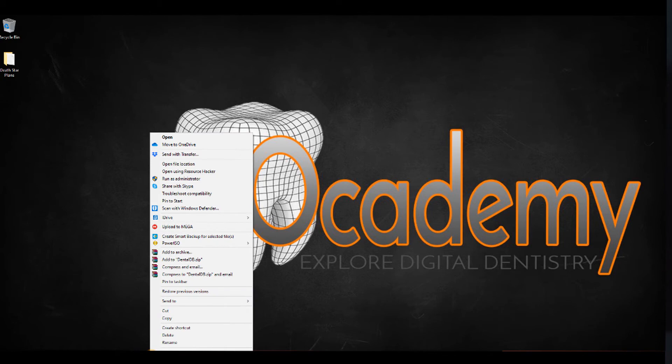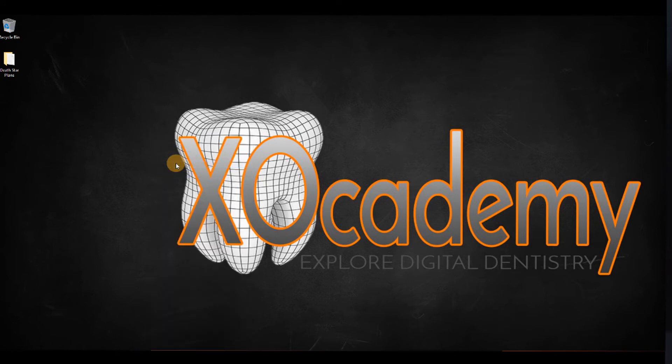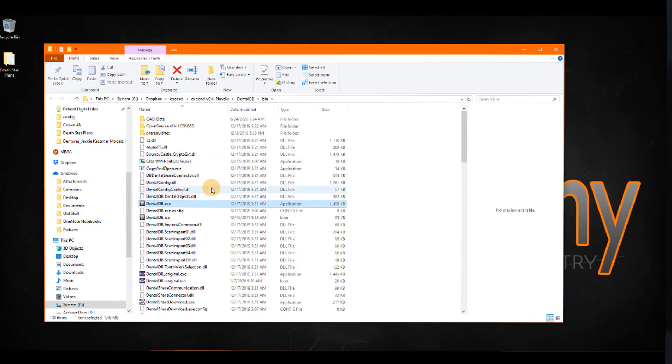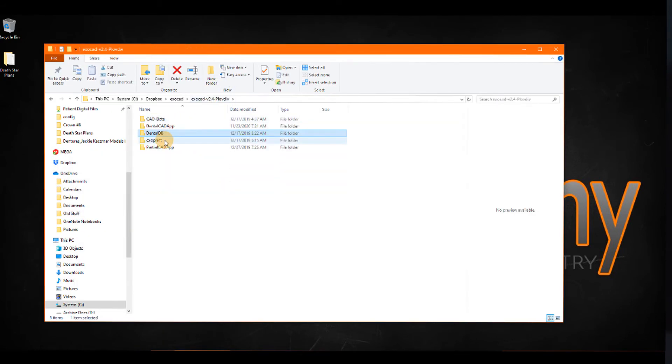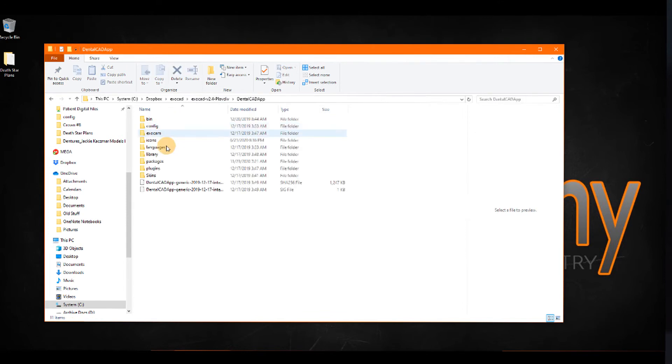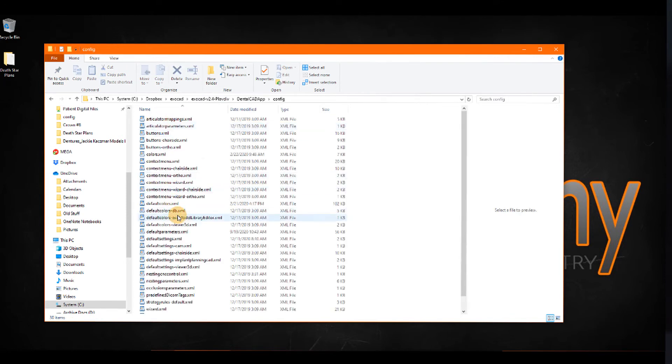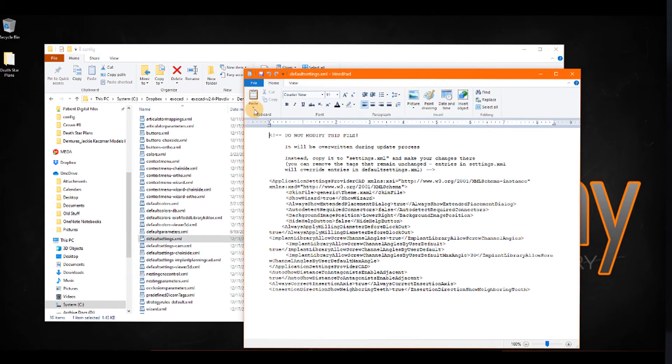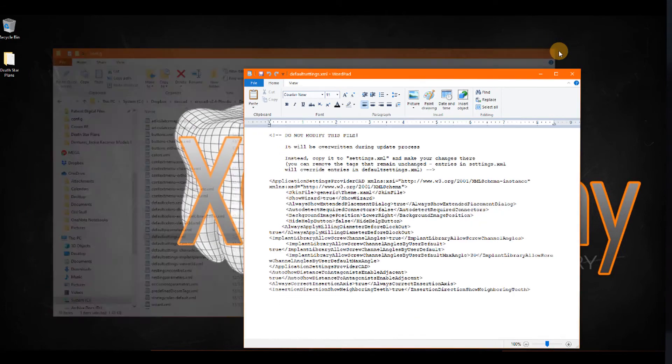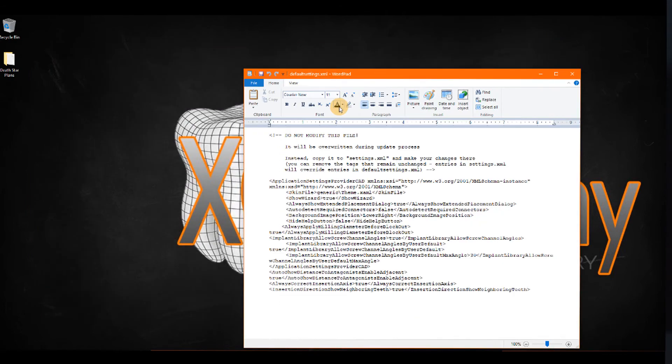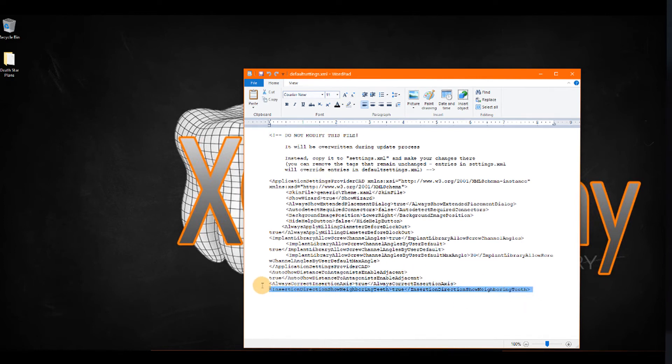I'm going to go back to that file to see what the issue is. So, DentalCAD app, config, and defaultsettings.xml. And, looking at this file, I've added my three tags here.